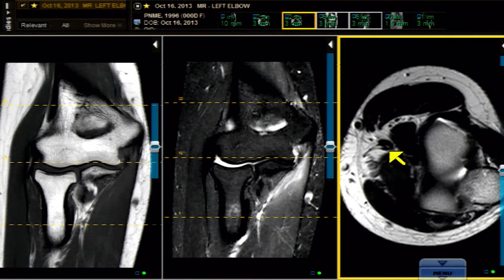Here's a 17-year-old with a pulling injury. Let's go somewhat basic — here is the ulnar collateral ligament anterior band. An important concept: it has anteroposterior length, so you could rupture the front, middle, or back of it. This is just the anterior band — it could be a full thickness rupture but doesn't have to be complete from front to back. Some fibers in the back may still be there, or the entire front-to-back extent could be ruptured. Those fibers would be torn and retracted, as I'll show in another projection.